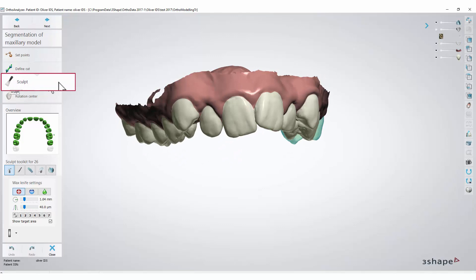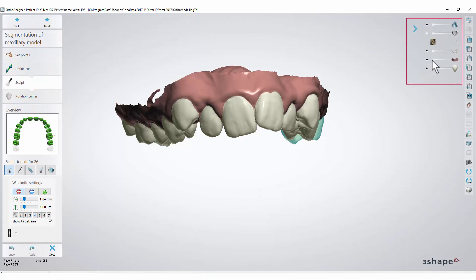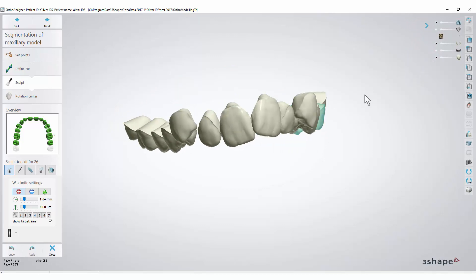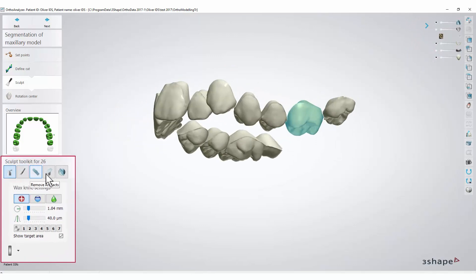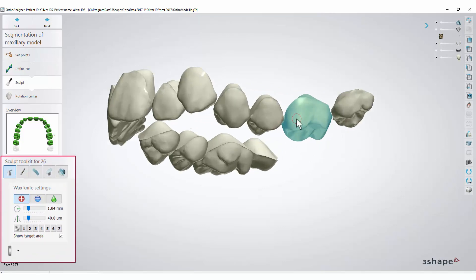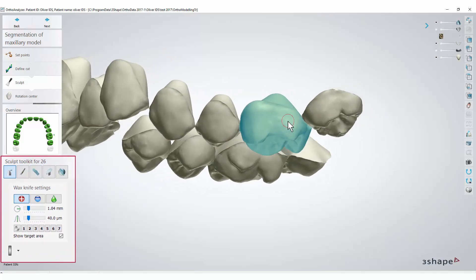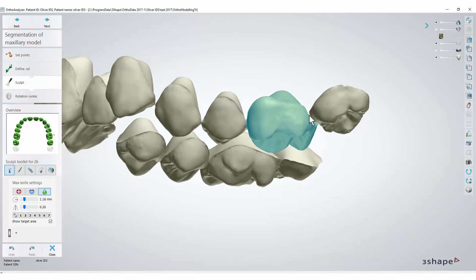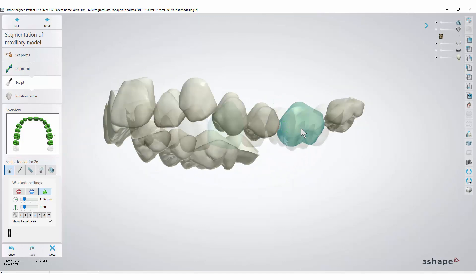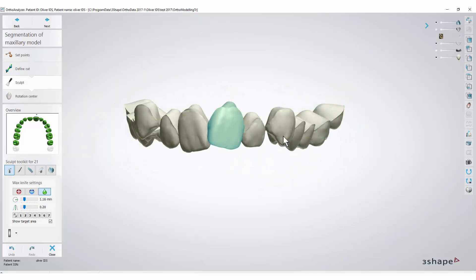Now proceed to the Sculpt Step. Since you have segmented the teeth and the gingiva into separate 3D objects, you can remove the gum and see just the teeth. At this step you can use the Sculpting Toolkit if you wish to make some alterations to the surface of the teeth. The Sculpt Tools enable adding, removing, or smoothing the surface of the teeth. When you are done, simply click Next.